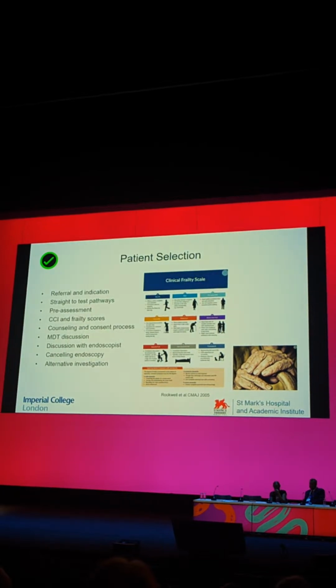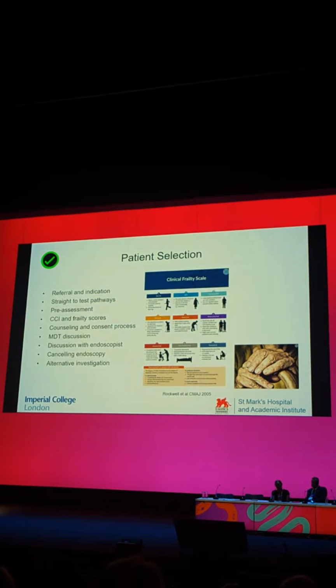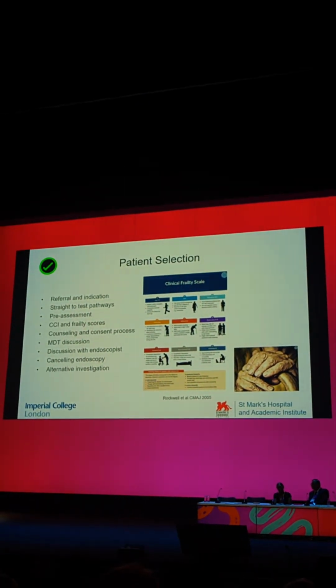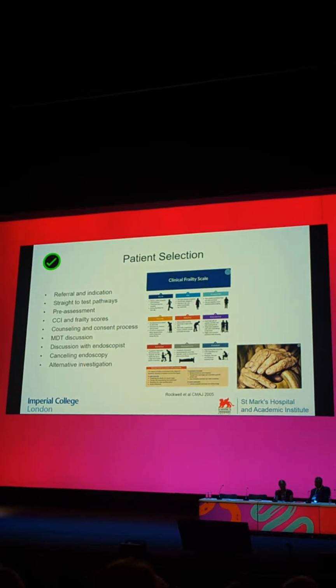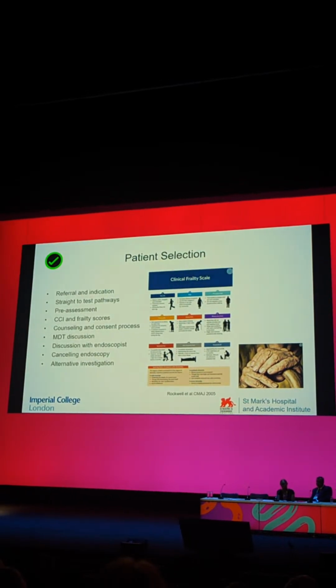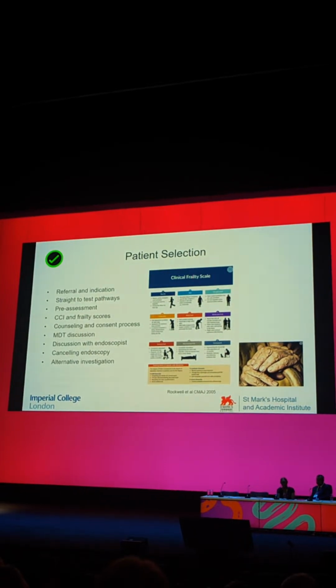Counselling and consent is a process, it's not just the yellow form, and it starts well before the endoscopy. And once you've made that decision, then it's really important to think about discussing it with the endoscopist that might be doing the actual procedure, because they may have a different approach. We all know that cancelling an endoscopy is really cumbersome and difficult, but it may be the best thing for that particular patient if you, as the endoscopist, don't think the indication is correct, and maybe presenting an alternative investigation such as appropriate imaging prior to endoscopy.